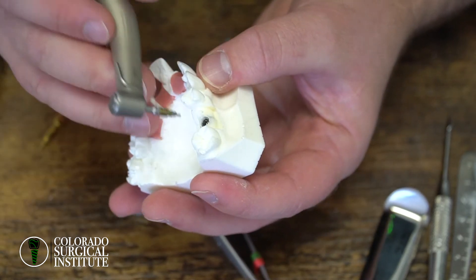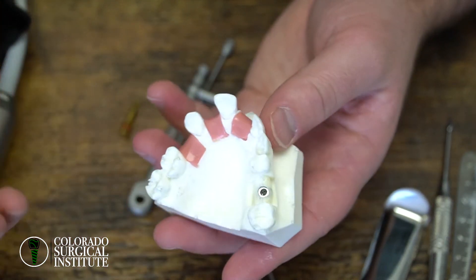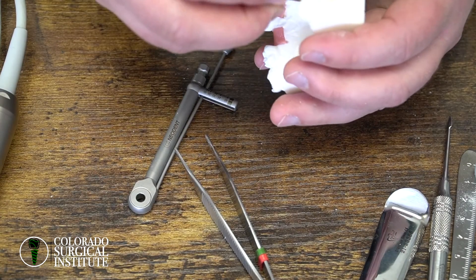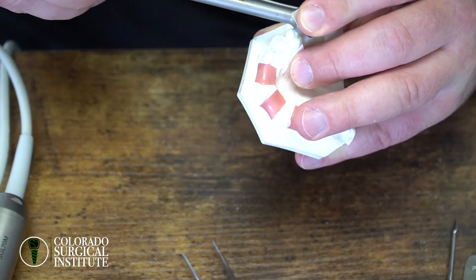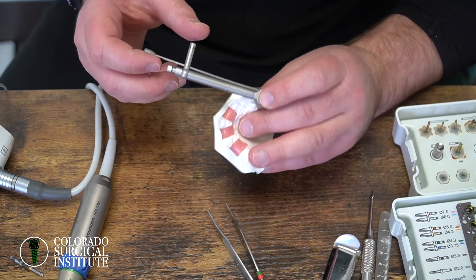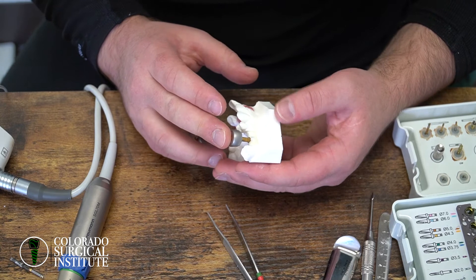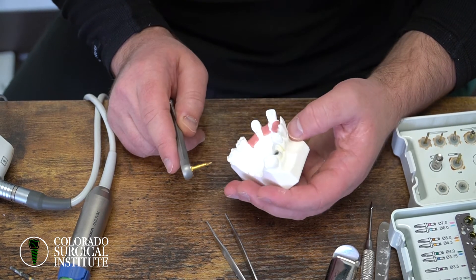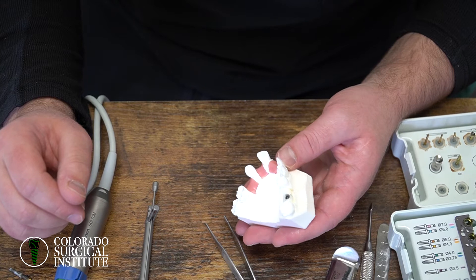You like where it is, you like the depth. At that point you can keep it and do primary closure. My cutoff for a cover screw versus a healing abutment is 25 newton centimeters. So if you measure the stability and it reads 25, you can place a cover screw or a healing abutment. But if it's less than 25 — say 10 or 15 and it's moving — that's not a stable implant. Your options are: put a cover screw on, close the tissue over the top, and wait at least 16 weeks for the implant to integrate into the bone.